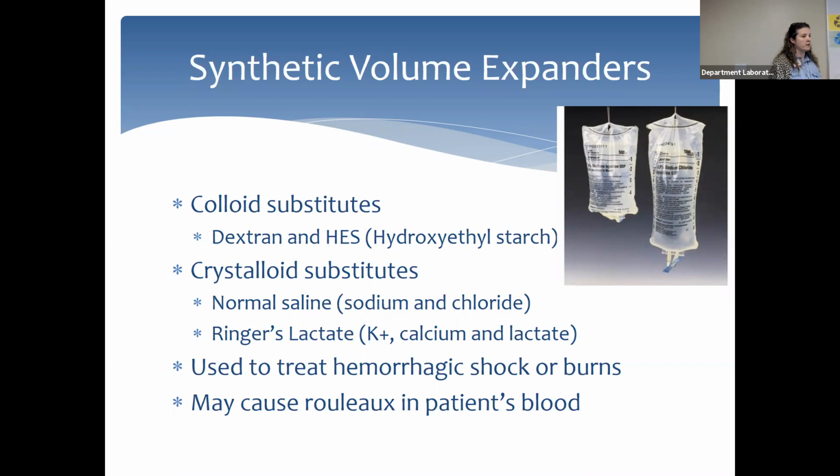When our blood products are being transfused into the patient, they are always diluted with normal saline, all right, 0.85 to 0.9% normal saline. Ringer's lactate should never be used when you're diluting your red cells or other products for transfusion. It causes rouleaux, all right? It causes the cells to come together. It could affect your patient's transfusion, okay? Ringer's lactate should never be used.